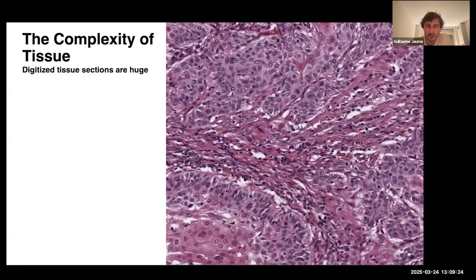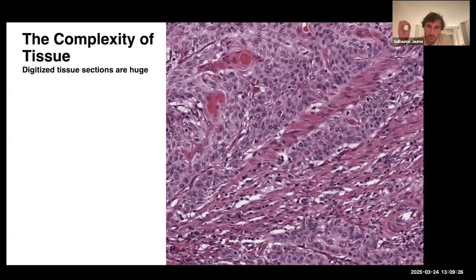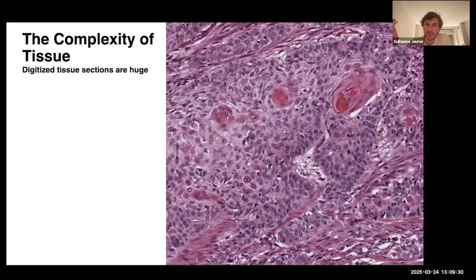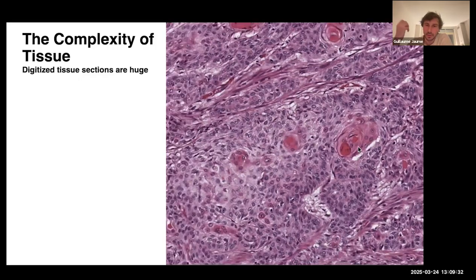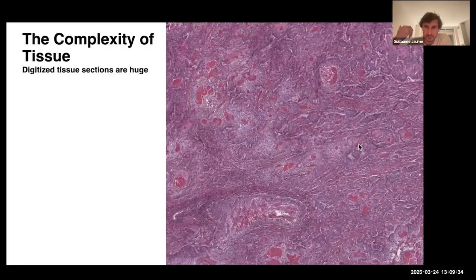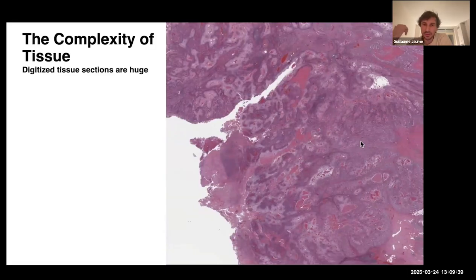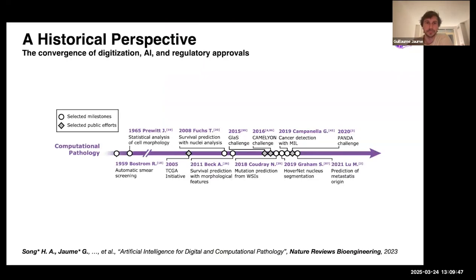It may sound like a detail, but this unique feature of whole slide images has basically been driving all the technological advancements of the field. So whatever we develop and whatever we want to translate from computer vision and AI applied to imaging will not always translate to our field simply because of this size bottleneck, right?